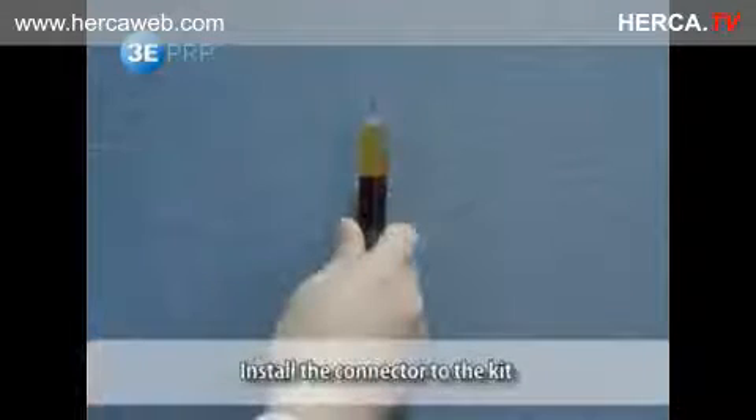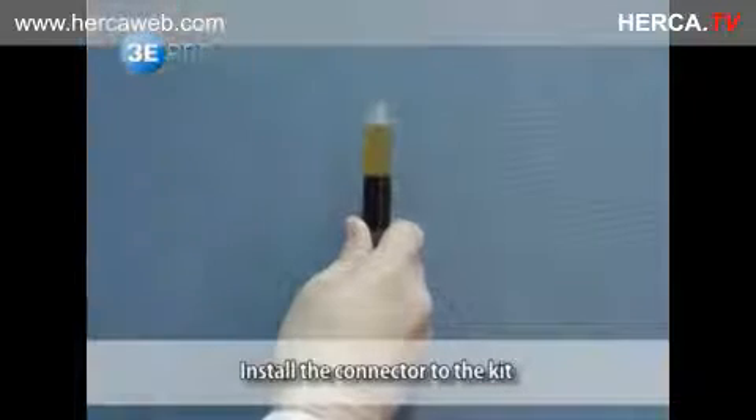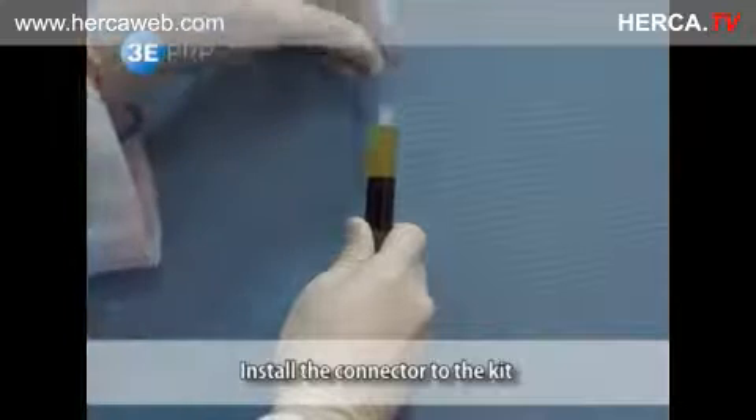When a sufficient amount of PRP is needed, install the connector to the kit and extract both the supernatant and buffy coat using the 5cc syringe.